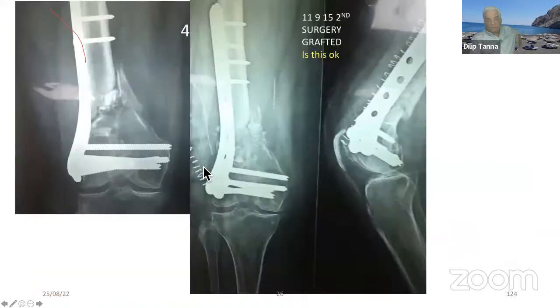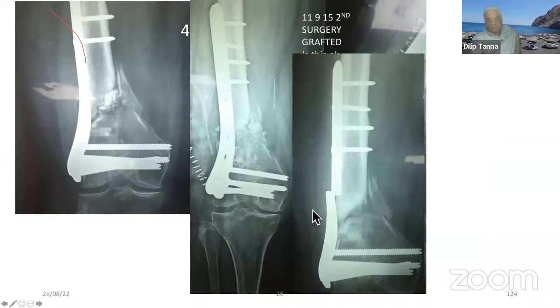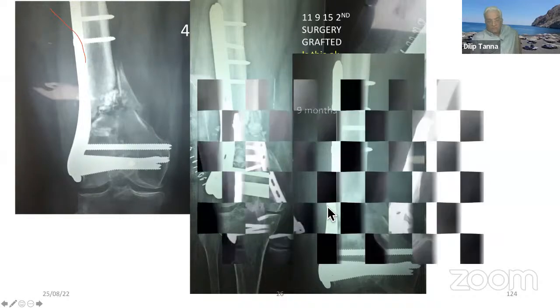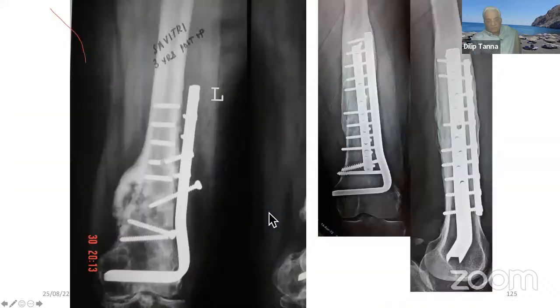So here it is. Now we went down and did the grafting because it didn't heal up. Again, the biomechanics was not all right. It is not the biology. The plate broke. This is the stage when I joined him to do the revision. And we did the double plating and the medial grafting, double unequal plates, and this healed up. The double plating is very, very important.